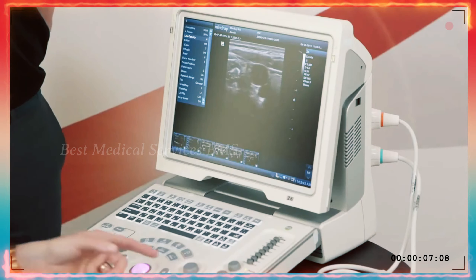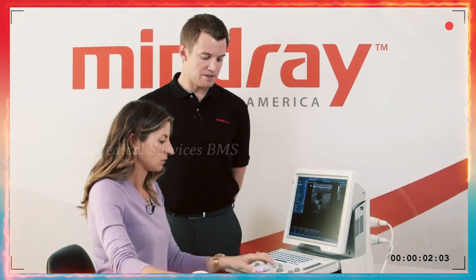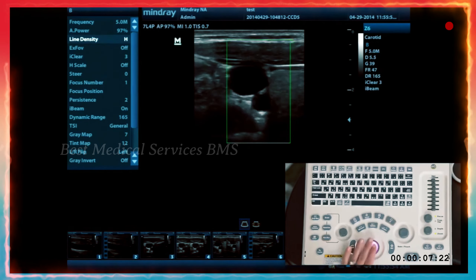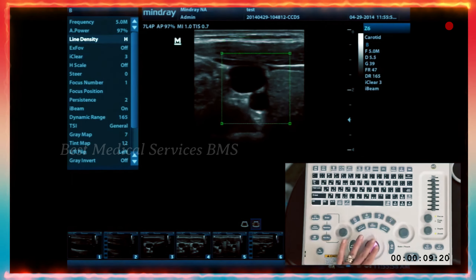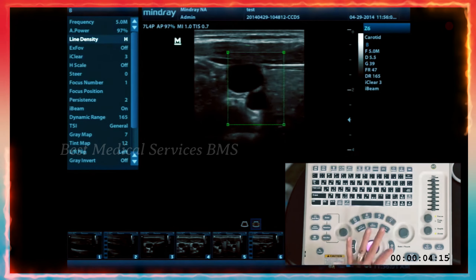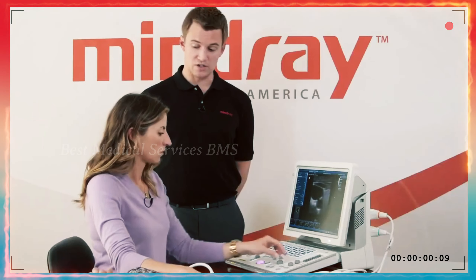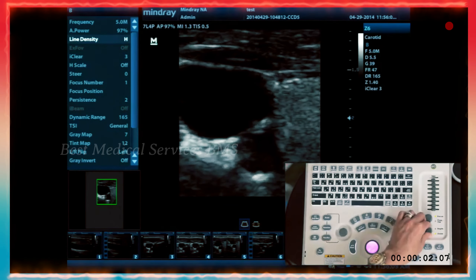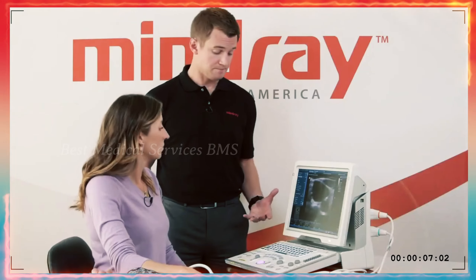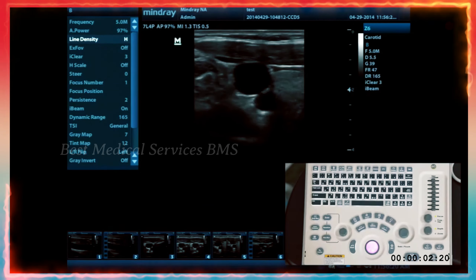The difference between zoom and iZoom: for the zoom knob, press down to get a box where you want to zoom on your image. You can change the box size using the trackball and set key, then press set again to lock it in. Now when you press the knob again, you've actually zoomed in. When you turn that knob you can zoom in quite a bit. Press zoom again to go back out to your regular image and back to depth.